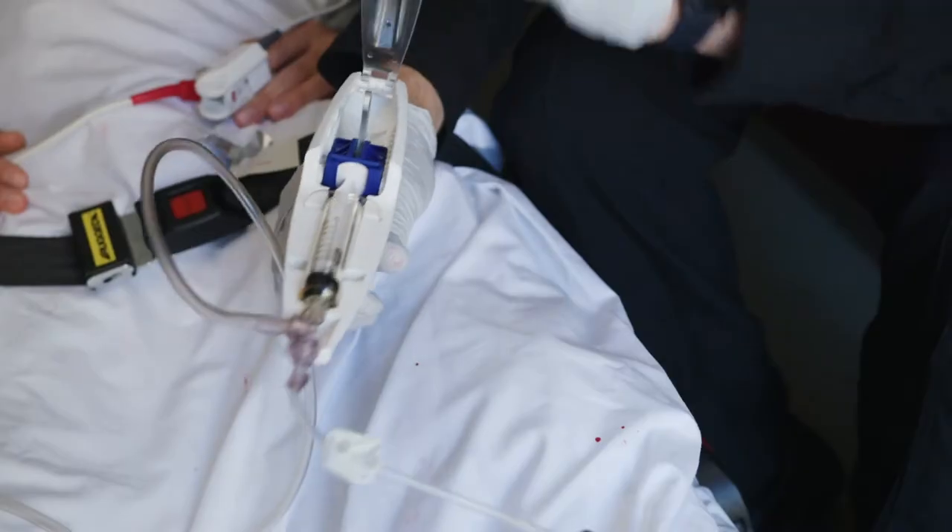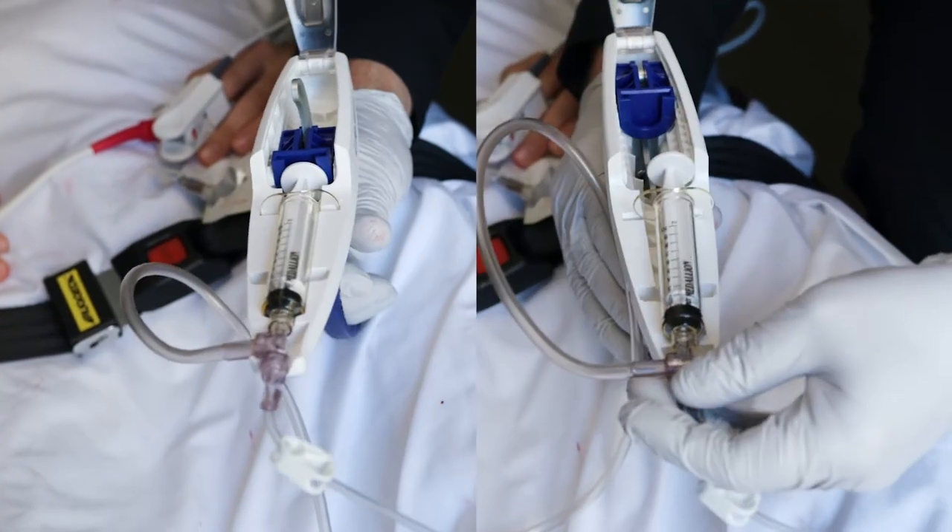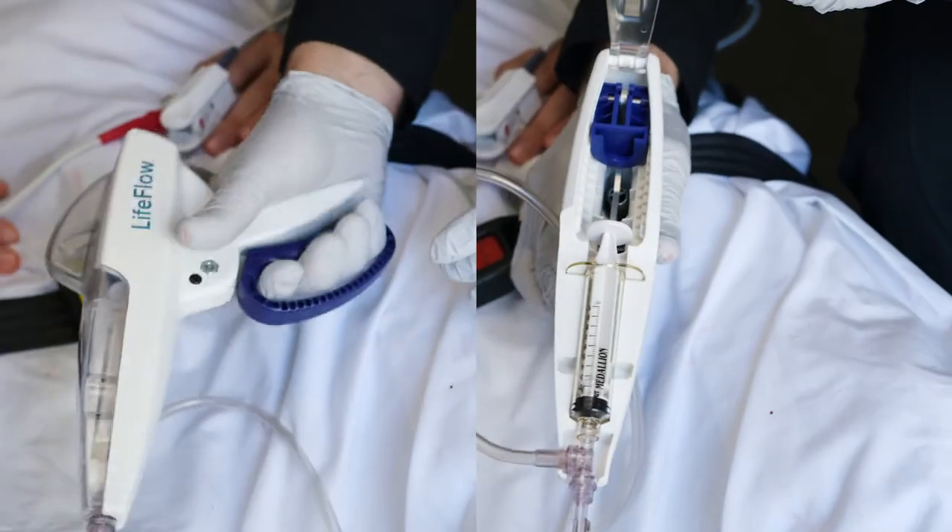When loading the syringe, make sure to seat the syringe in the blue shuttle. If not seated correctly, the shuttle will not engage the syringe.